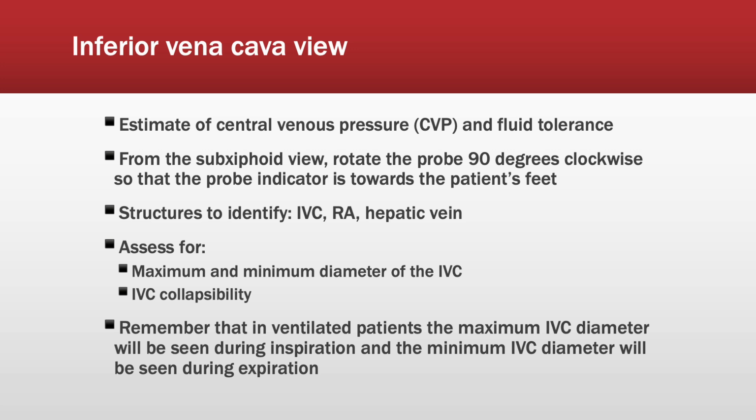The hemodynamic counterpart to the aforementioned thoraco-abdominal interaction is the increase in blood return from the IVC to the right atrium, leading to a reduction in the size of the IVC and a transient increase in stroke volume.